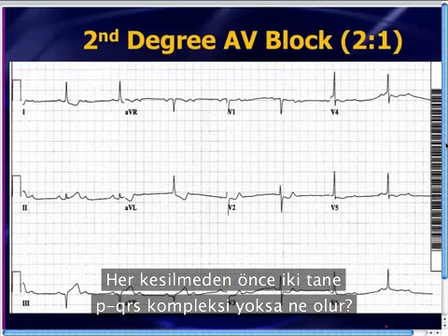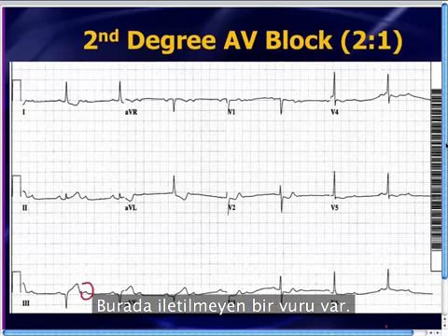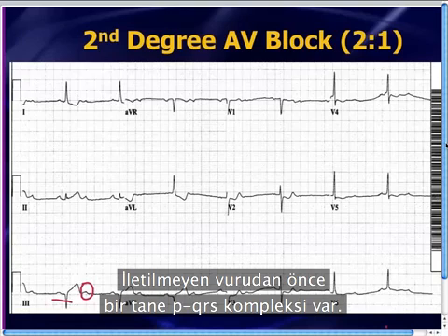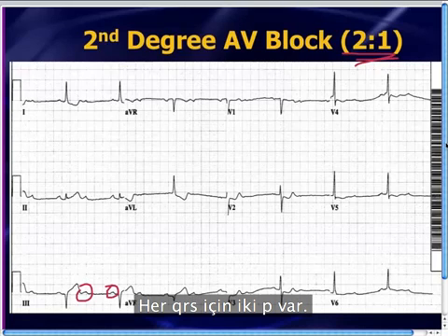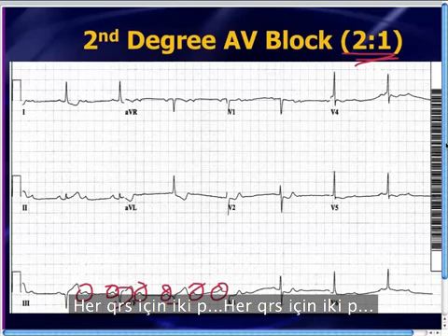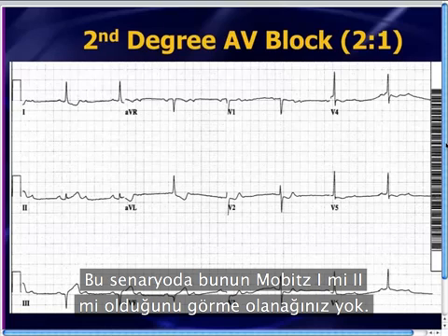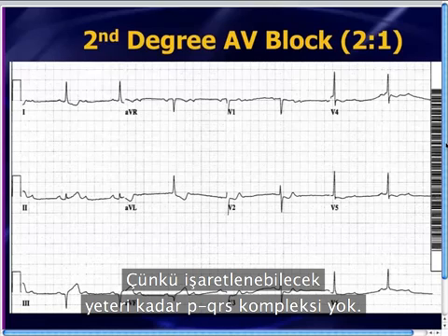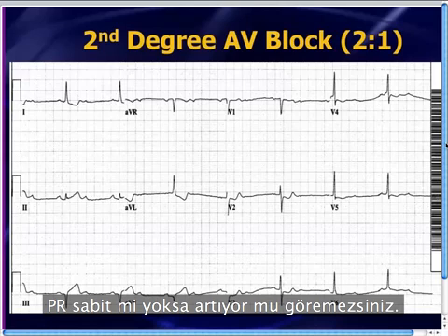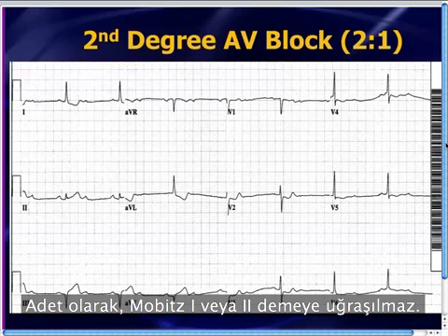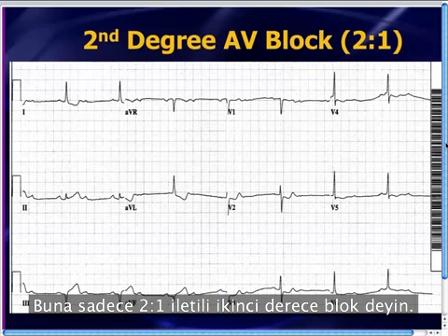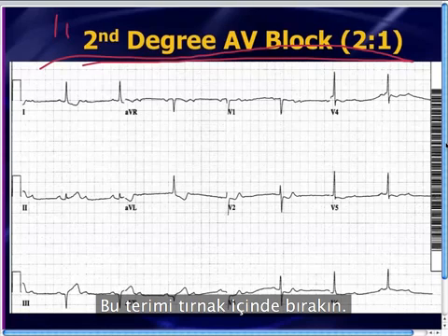What happens if you don't have two PQRS complexes before each drop? Here's a dropped beat — a non-conducted P wave — but there's only one PQRS complex before your non-conducted beat. This is a second-degree AV block with only 2-to-1 conduction: two P waves for every QRS. In this scenario you really don't have the opportunity to see whether this is Mobitz 1 or Mobitz 2, because you don't have enough PQRS complexes to see whether the PR is increasing or staying constant. So simply call it second-degree AV block with 2-to-1 conduction.